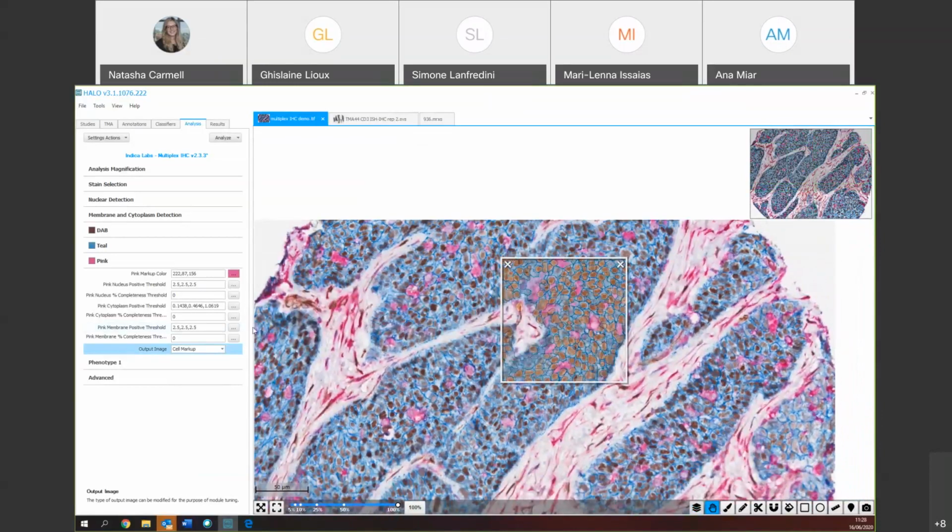Well, I can show you what the program would do, maybe if I decrease this a tiny bit more, just to create some false positive, just for you to understand what I mean. Okay, so I've created a false positive here. So basically, this cell would be positive, and this one next to it is taking the cues of the other cell to say that it's positive.